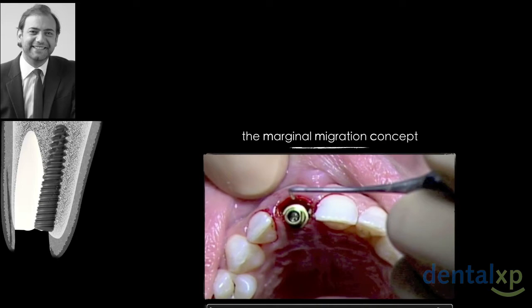Number one reason, we all know it today, the critical coronal part of the buccal plate is tooth dependent. We know today that the bundle bone will resorb. One way to solve these cases is to make a flap and overcorrect the region. The other way, in order to compensate for this loss of the bundle bone, is to place a membrane, as you see here, and graft the area with slowly resorbable material, like bovine bone.